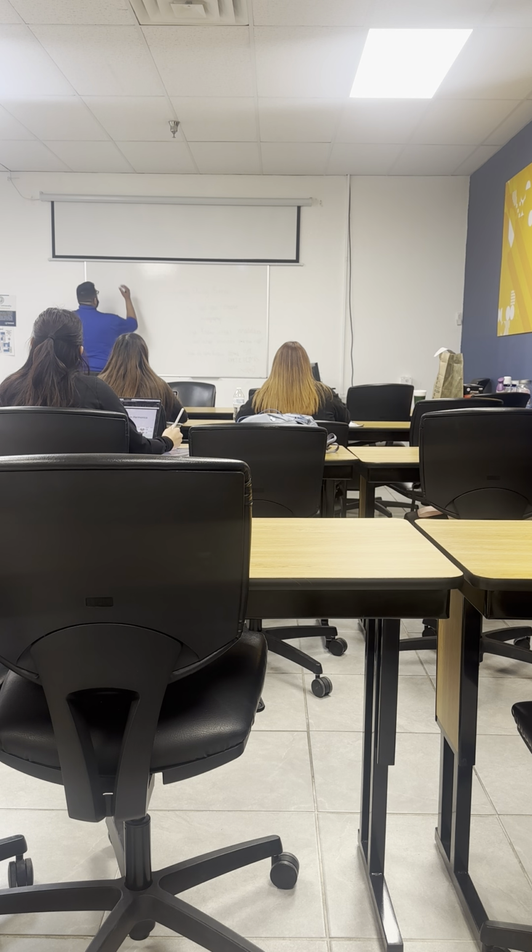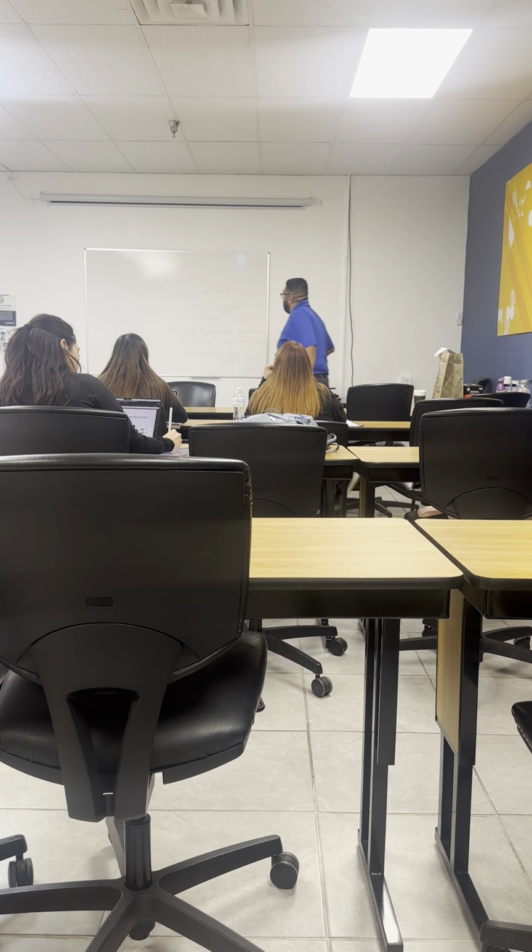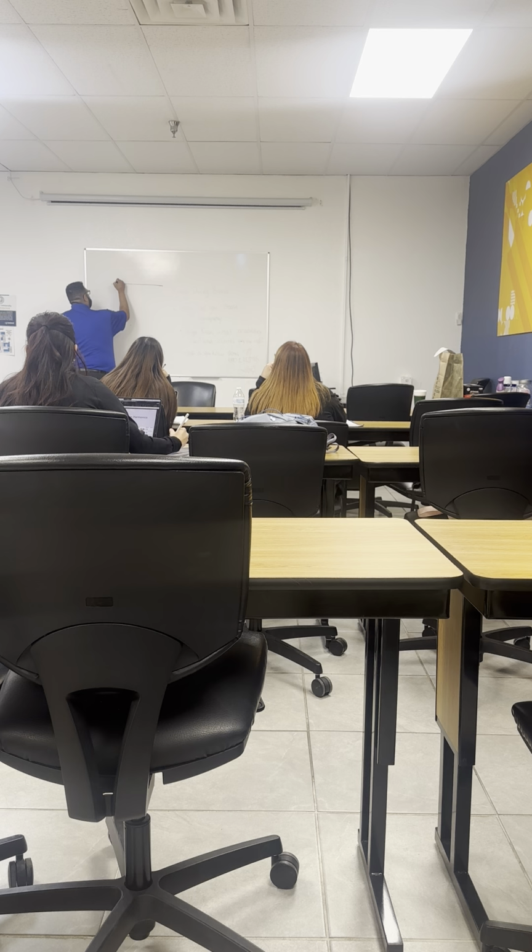All right, so we have a scan line, right? A pulse is sent out that scan line. So let's just say that this is our pulse. Now the machine will send out the inverse of this pulse, which means that it'll be like that. But what lies within the bandwidth of these pulses?